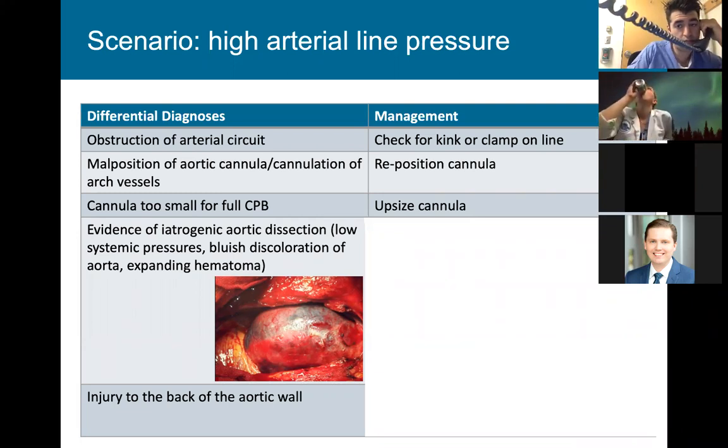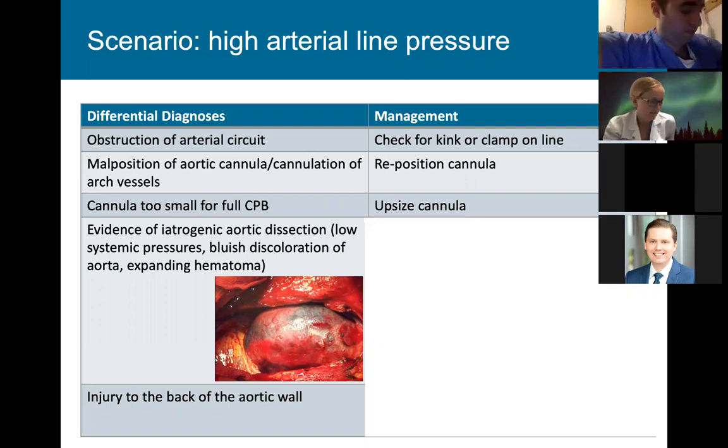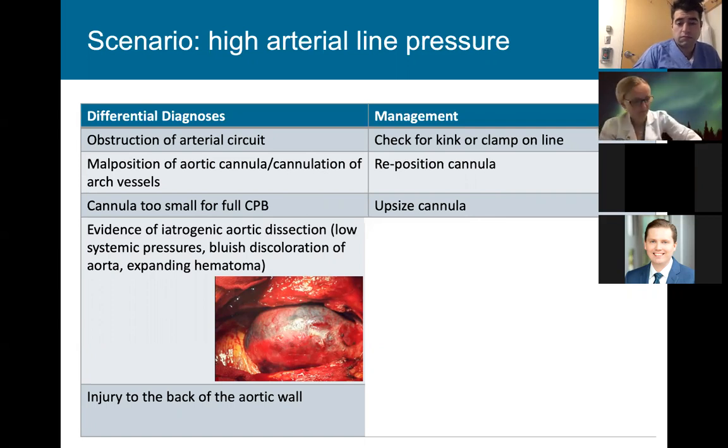So number one, I'd ask Dr. Sunt or whoever my attending is to come back. But I would immediately start. I would want to re-access for my arterial circuit somewhere. So if I'm centrally cannulated, I could think about cannulating femorally, and I'd want to get new access and start cooling immediately so I could circ arrest.